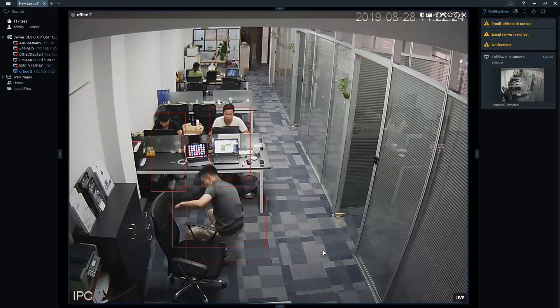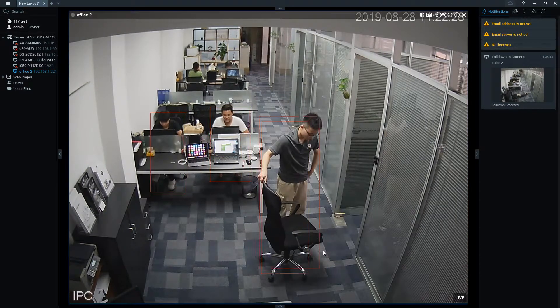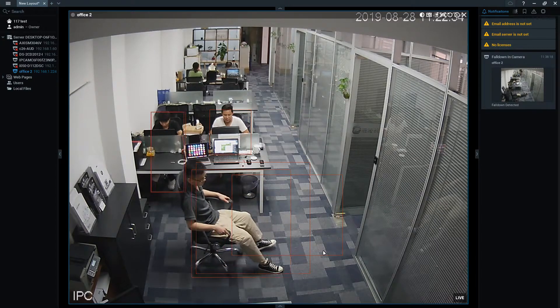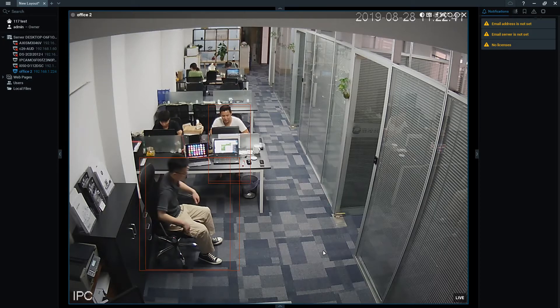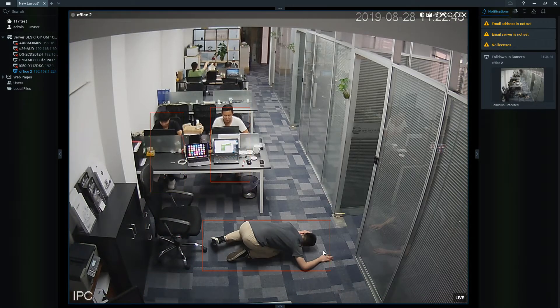Can we move to the next posture? Now, if he just sits down fast on his chair to take a rest, the alarm won't go off because it is sitting on the chair, not falling on the ground. But if he falls down on the floor again, the alarm will definitely pop up on the right.